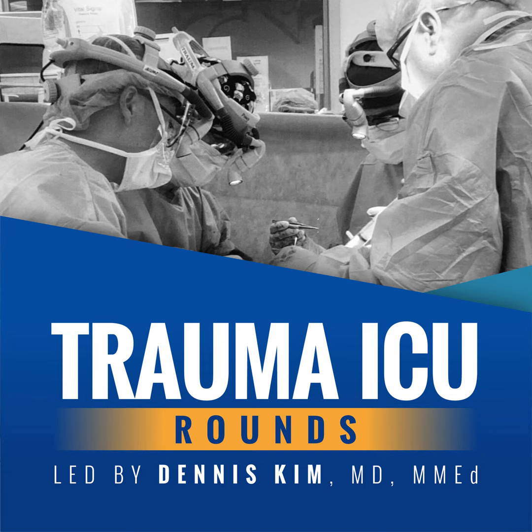So by choosing either volume or pressure, we determine the control variable that will be used to establish gas flow into the patient's lungs. The key point here is that control variables are independent variables, meaning that if we decide to use volume, say, as the control variable, the tidal volume selected will be constant and independent of what is happening with the peak airway pressure, which will vary from breath to breath depending on the underlying resistance and compliance of the respiratory system at any given time, or when a patient's efforts change.